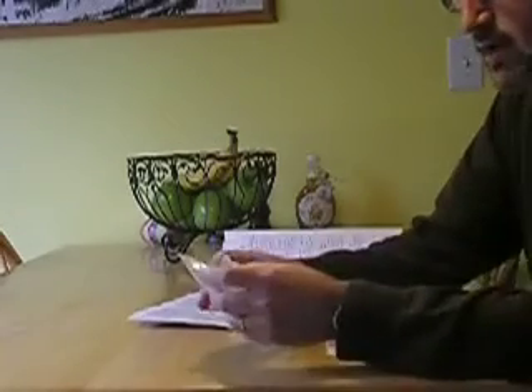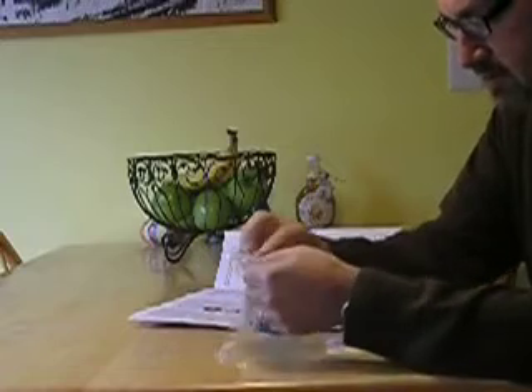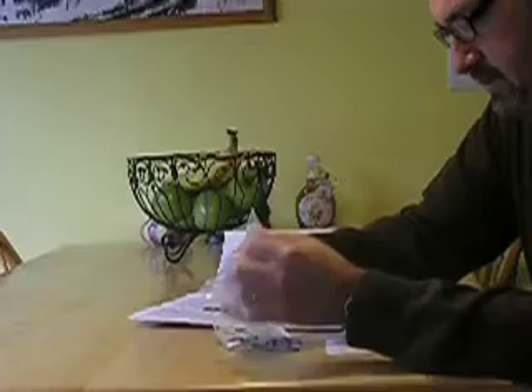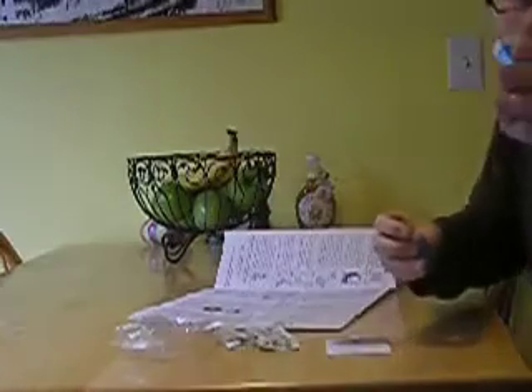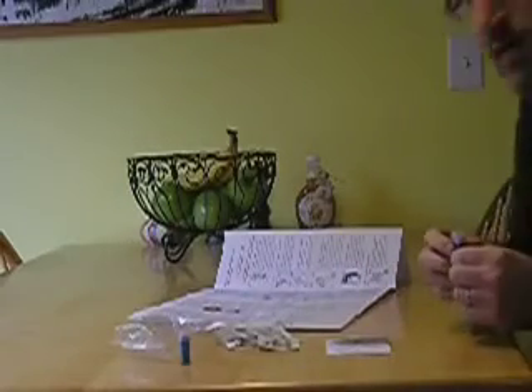Here we go. I've got a little kit, got these little lancets here. These are what you can use to poke your finger. They give you two of them — I'm thinking because I'm not sure the first one is going to work.